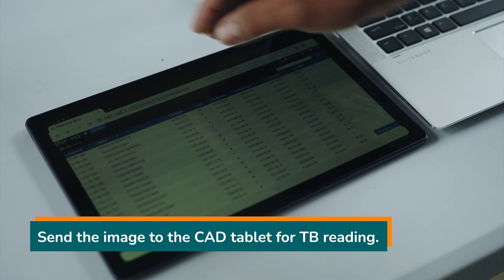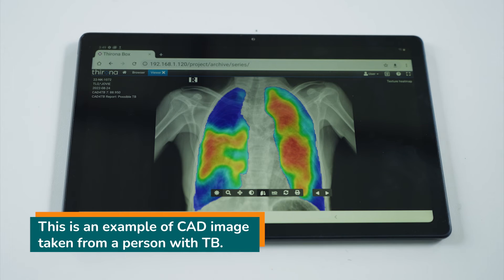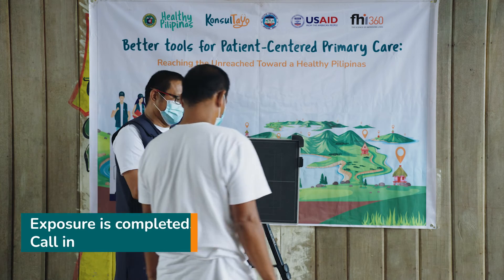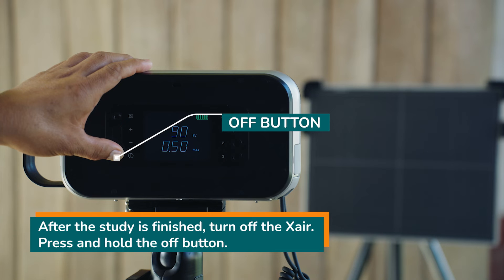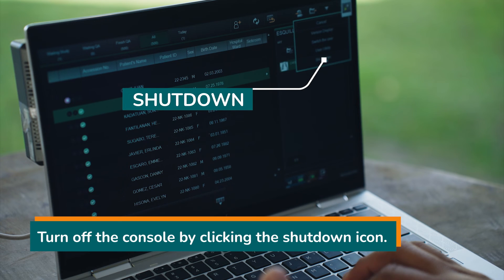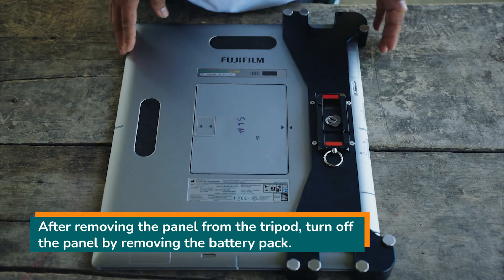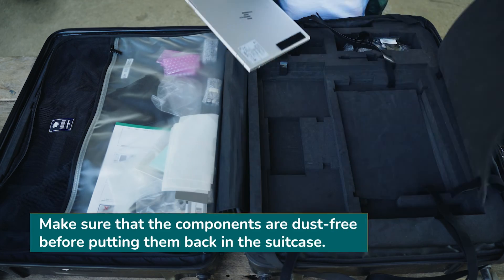Confirm that the entire lung field is included in the image and confirm that there is no blurring of the image. To finish exposure, click the green complete button. Send the image to the CAD4 tablet for TB reading. This is an example of a reading of a person with tuberculosis. Exposure is completed. Call in the next client. After the study is finished, turn off the X-ray. Press and hold the off button. Turn off the console by clicking the shutdown icon. After removing the panel from the tripod, turn off the panel by removing the battery pack. Put the components back in the suitcase.